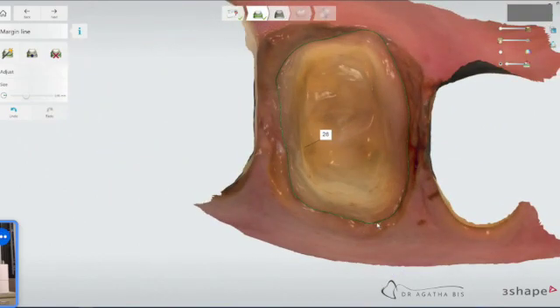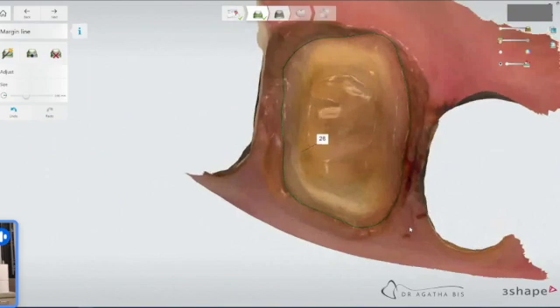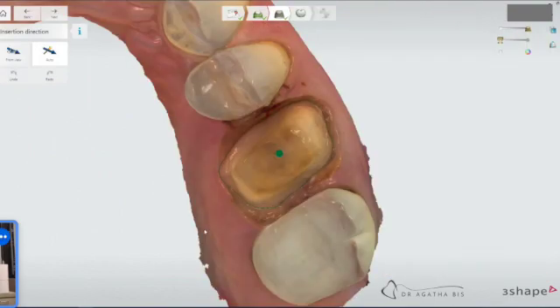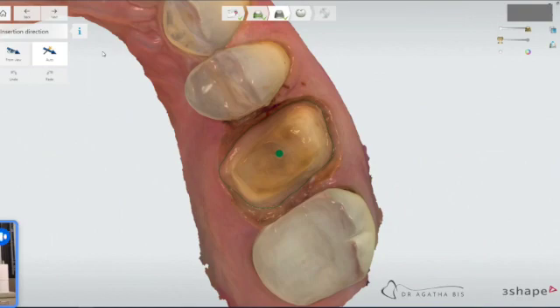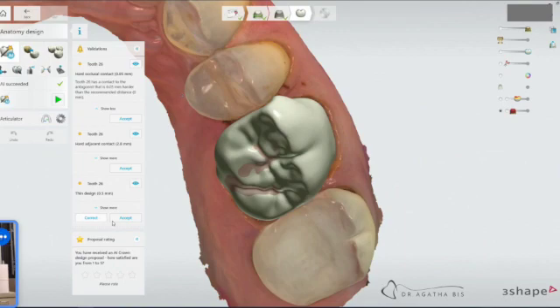I mean, you could spend a ton of time here or very little time. The insertion direction, I just leave as auto unless I'm doing an onlay and that's in a different video. But for crowns, I do the automatic insertion direction. And then we wait for the design.